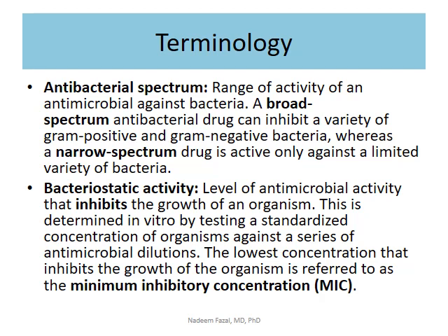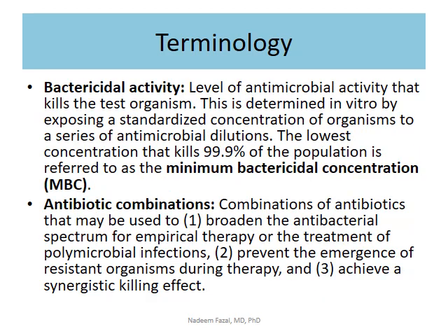And then we also want to find out how much we need, because we don't want to overkill. You don't want to use too much antibiotic. You remember where that comes from? Because of disruption of normal flora. You don't want to do that. So you want to go for the minimum possible drug concentration. We call it minimum inhibitory concentration. That's why you check on the plate, and you have to look at the dilutions and so forth. Okay?